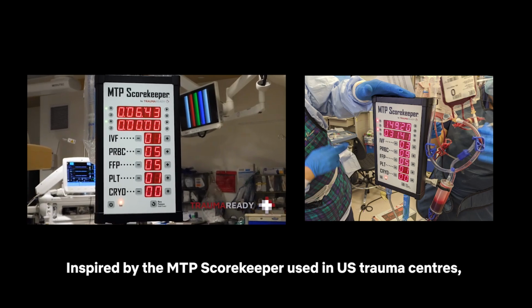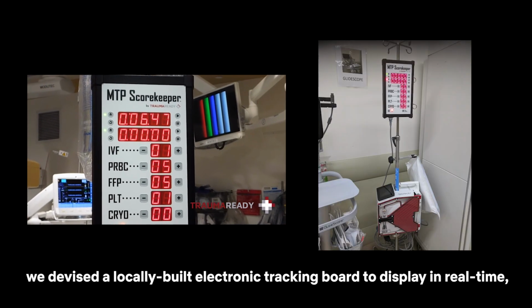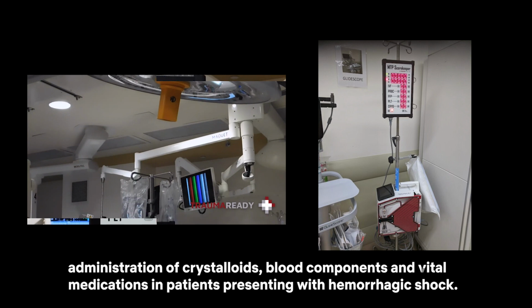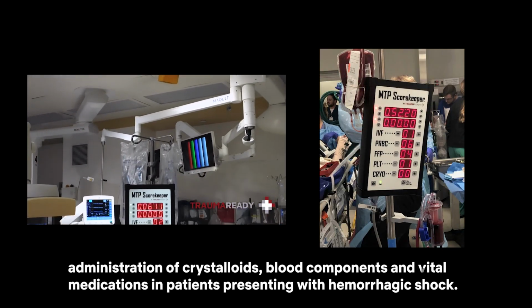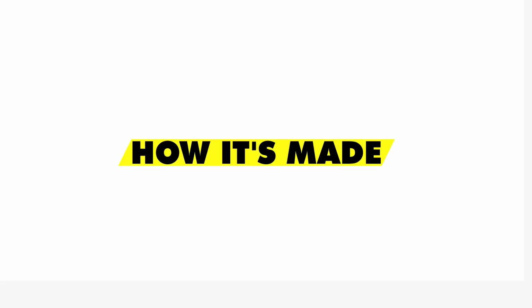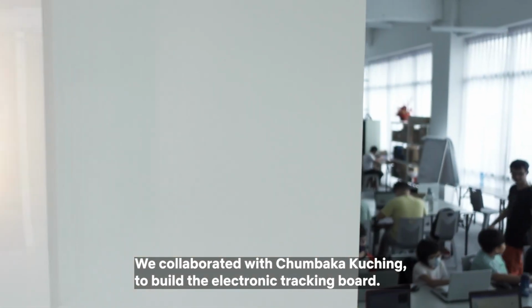Inspired by the MTP scorekeeper used in US trauma centers, we devised a locally built electronic tracking board to display in real time administration of crystalloids, blood components, and vital medications in patients presenting with hemorrhagic shock. We collaborated with Chumbaka Kuching to build the electronic tracking board.